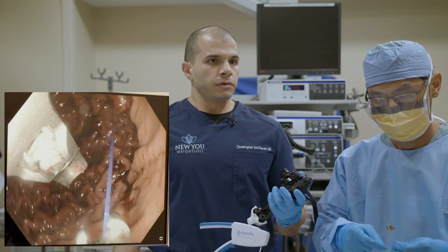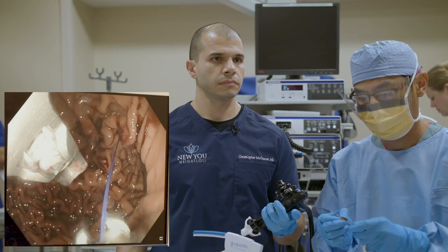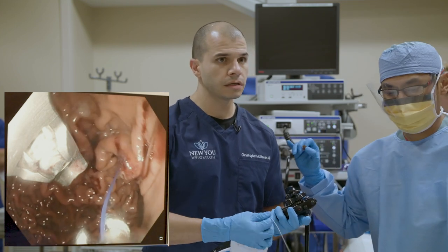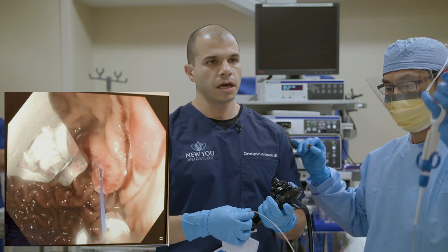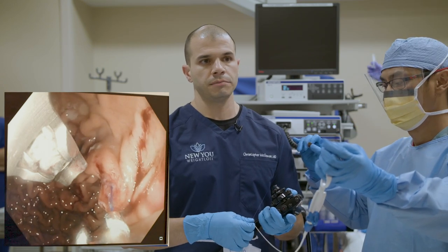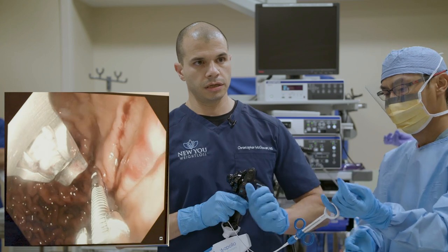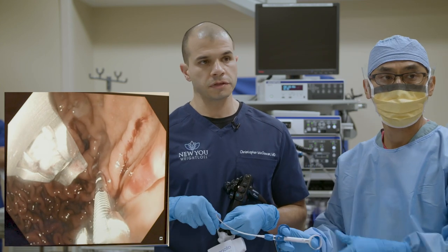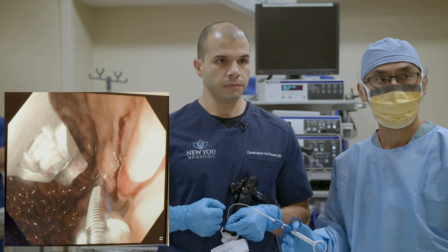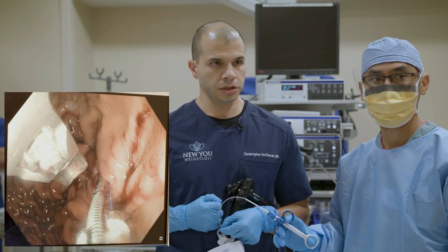Question from Keith: do we do these procedures in a hospital or a clinic? We're currently in a hospital, and this is an outpatient same-day procedure. It can be done in an ambulatory center, but we're currently at the hospital where our team is located. It's same-day — she'll wake up, recover for about an hour to two, and then go home. She traveled from a bit outside of town, so she'll stay around for a day or two and then go home.